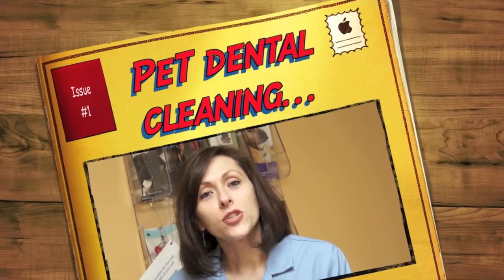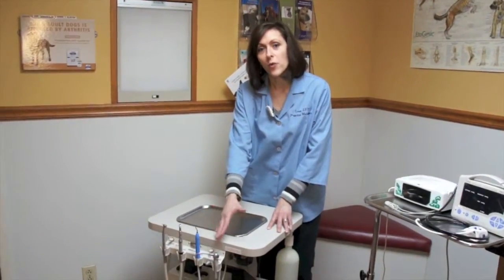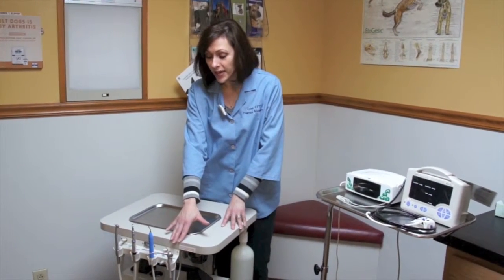I'm going to be performing a dentistry using a Dental Air dental unit. This particular unit is very nice because it is a portable unit which has its own compressor and its own water supply. Other parts of this unit which make it a really nice functional unit is that it has a water air mist gun, so we can rinse the teeth off as well as apply air to sites so we can look, make sure we're not missing anything during the dentistry.